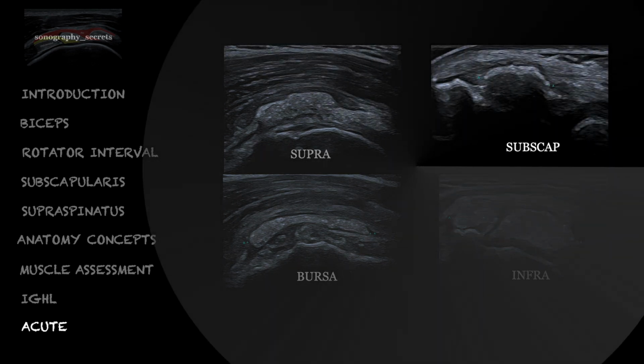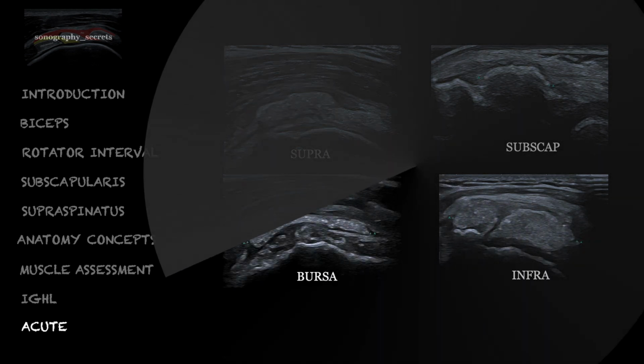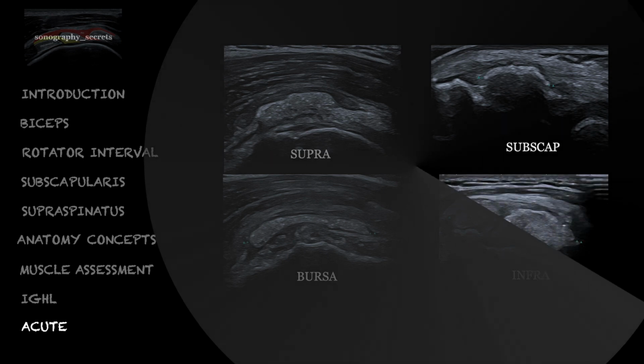The most common acute presentation of shoulder pain that we encounter is that of acute calcific tendinosis, or hydroxyapatite deposition disease. Patients will present with an insidious onset of excruciating pain with globally reduced range of movement. Some clinicians will refer this query early frozen shoulder, but with this level of pain, it's calcium every time.